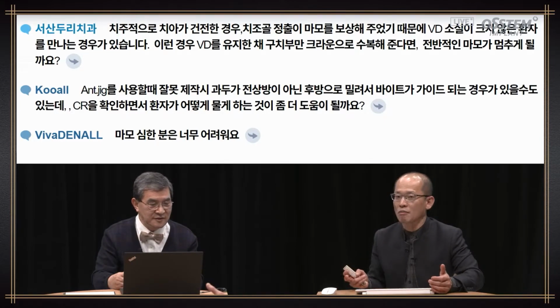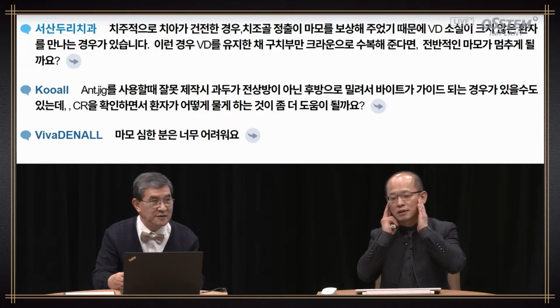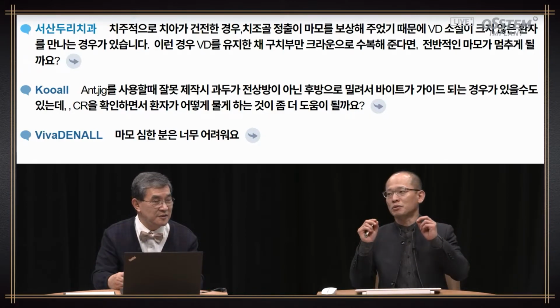I think it's based on the doctor's experience, and I also have that experience. In principle, anatomically, if you take the panorama picture, 3D-wise, the space and soft tissue all make it difficult to make correct determinations. But the anterior jig should not be convex. It needs to be flat, or it's better to be concave. But if the thickness is too thin, then it's not useful.